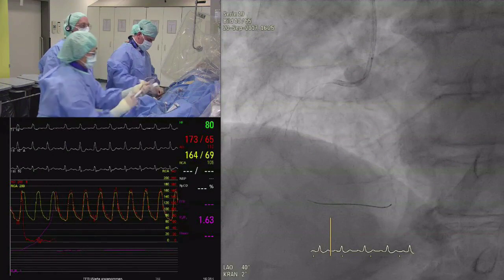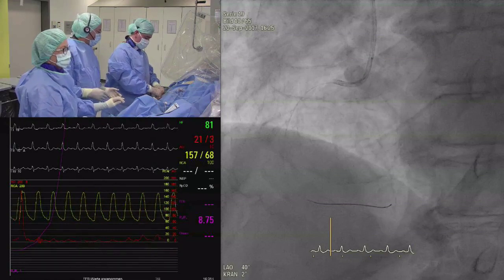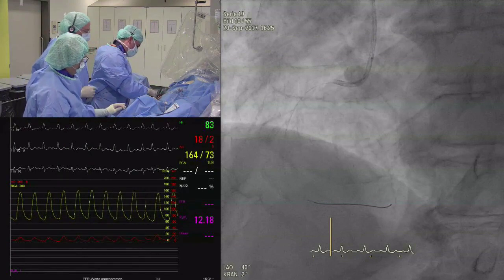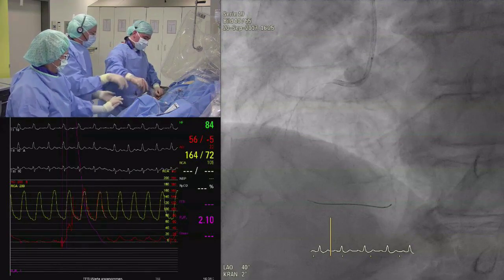Is that right? Yeah. Did you mention this was a left bundle? Yes, it is a left bundle. The distal pressure was quite high, so we were assuming that the patient did not feel any chest pain and there was no ECG changes during the balloon inflation because they have good left collateral. Well, he has left bundle branch block, so it's difficult. It's an interesting case.